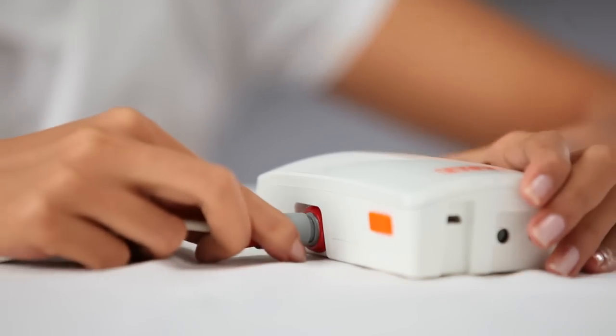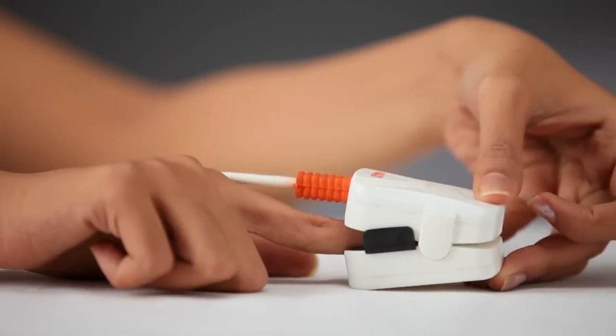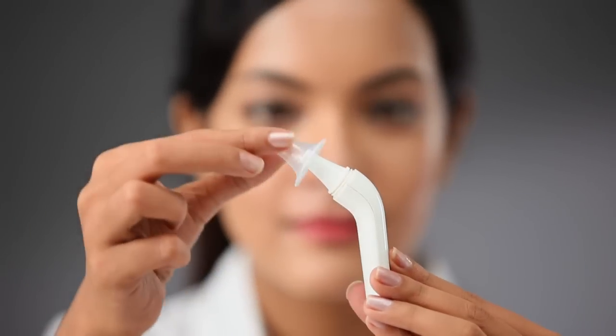Similarly, you can use Bolt to measure blood oxygen, body temperature, and blood pressure and glucose levels.